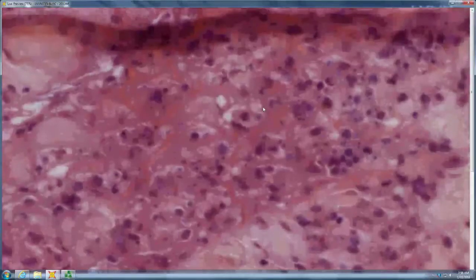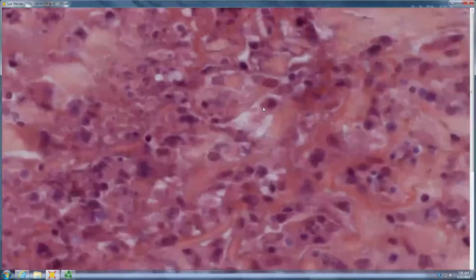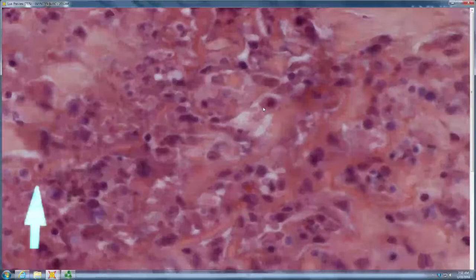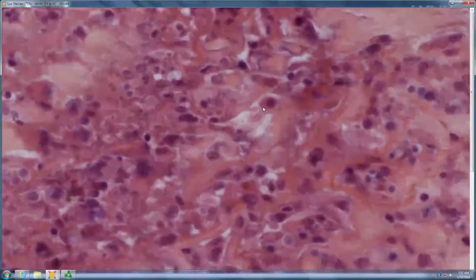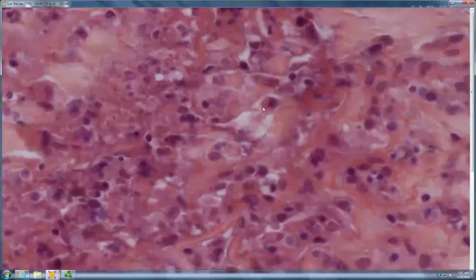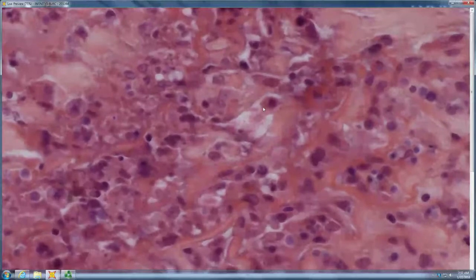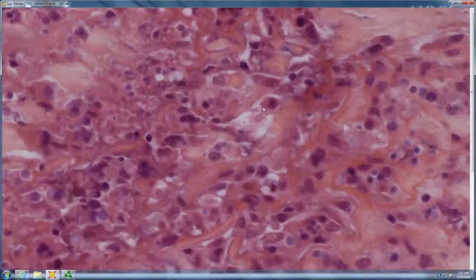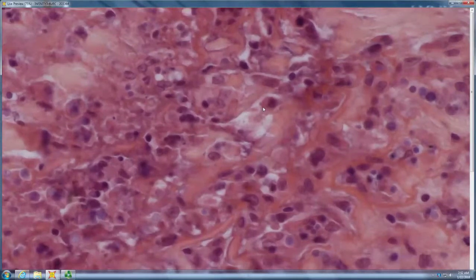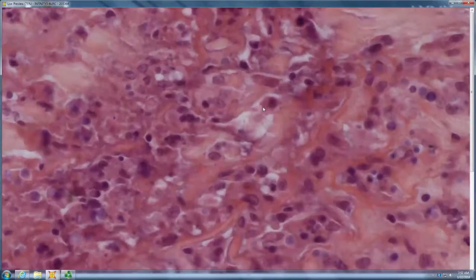So what are you thinking? Prototheca. Yeah, exactly. So Prototheca is an algae, kind of lives right at the junction of algae and fungus. Primitive organism, lives on tree slime in the south. So states where they grow telephone poles and paper, so Georgia, Alabama, South Carolina, Florida, any of the states that grow telephone poles is where workers get Prototheca infections.